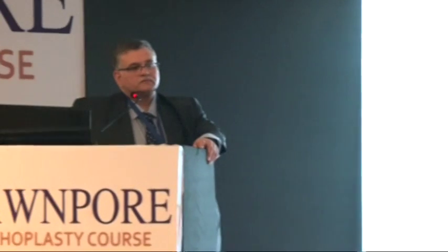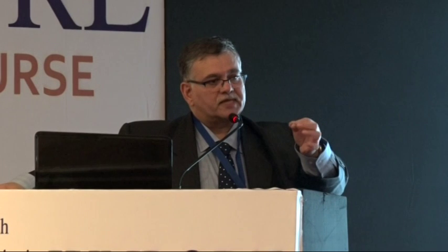I don't use cement at all because it'll fail. So even if there is a contained defect, I will use all the surrounding bone, crush it up, pack it in, and leave a trial stem in the hole that I've made, in the form of a drill, because you don't have a trial stem, and pack the bone around it to reconstruct the area and then put this component in. But I don't believe cement does the job.